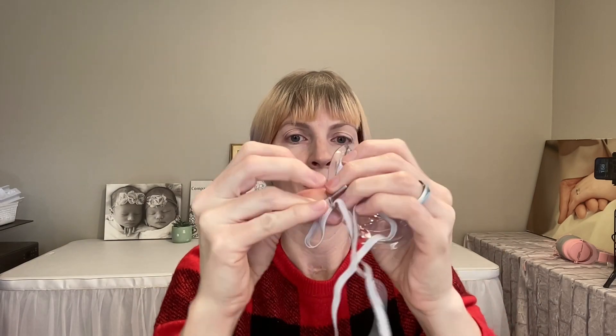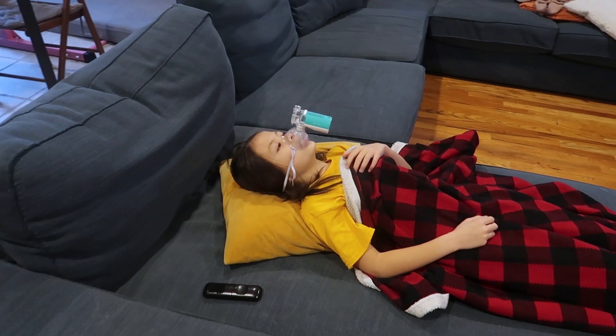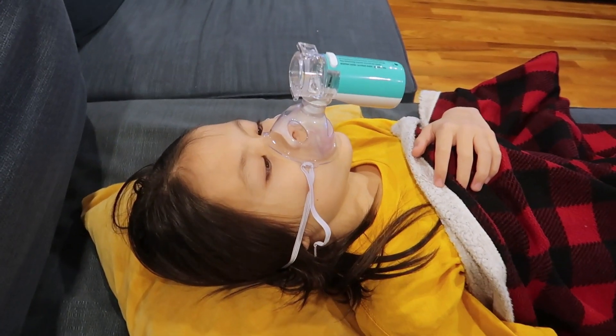It also comes with two elastics that are very stretchy, in case you want to attach the mask around the back of your head. Those are handy — you don't even have to hold it when you have the strap on.